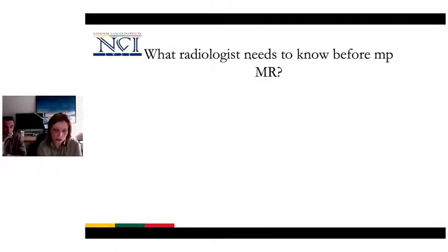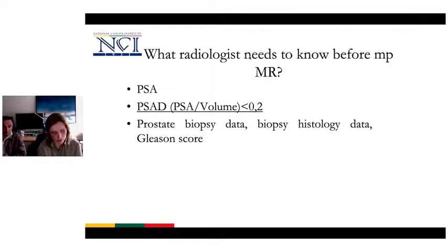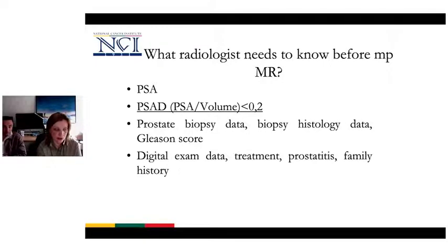What does the radiologist need to know before MRI? It's PSA. We should calculate PSA density, and it's good to know previous biopsies, biopsy data, and Gleason score. Also if the patient uses some medication or if we have treatment ongoing, because it's really important when evaluating MRI.